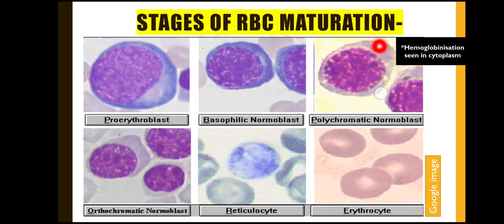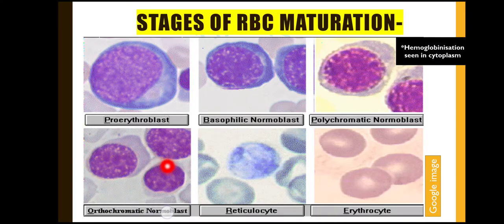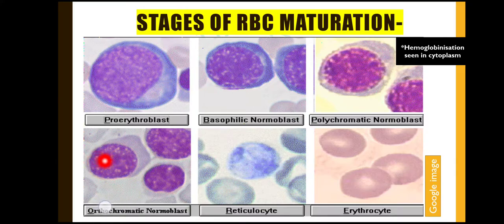This is an important point: hemoglobin synthesis can be seen by Romanowsky stains at the polychromatic normoblast stage, also called the intermediate normoblast. The chromatin is more condensed than in the basophilic normoblast. The third stage is the orthochromatic normoblast, also known as the late normoblast. Here the chromatin is further condensed, the cytoplasm is grayish in color, the nucleus is eccentric, and it is ready to be extruded out of the cell.